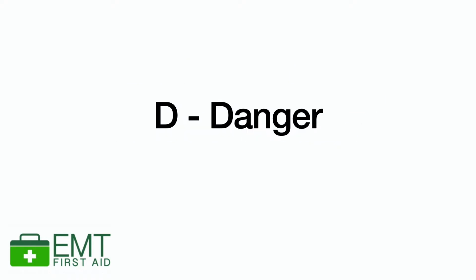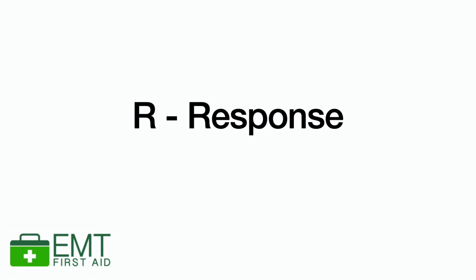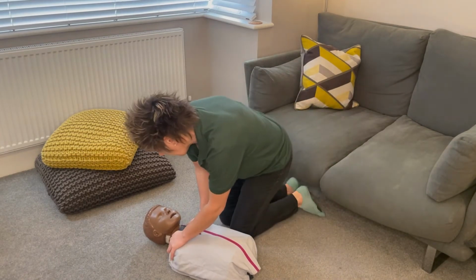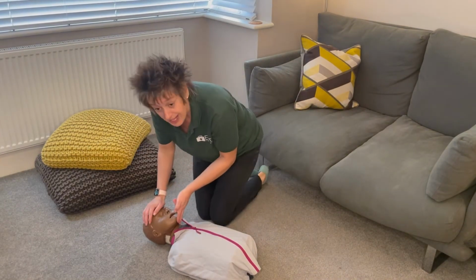We're going to check the area for danger. We're going to check for response. We're going to see if they respond by pressure, by talking to us, by making a loud noise next to them to see if they wake up. No response, I'll probably shout for help.